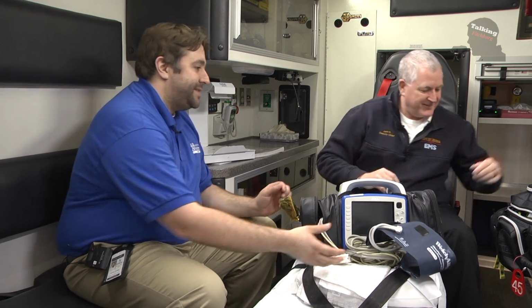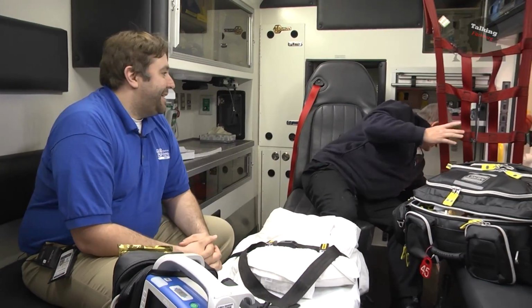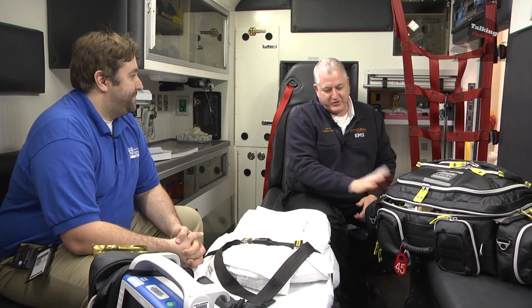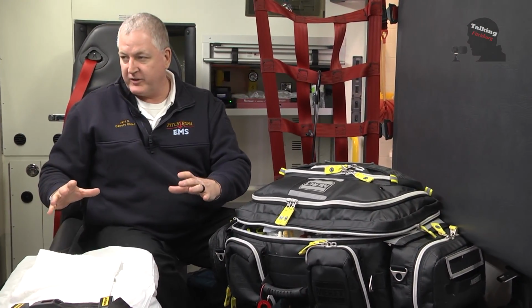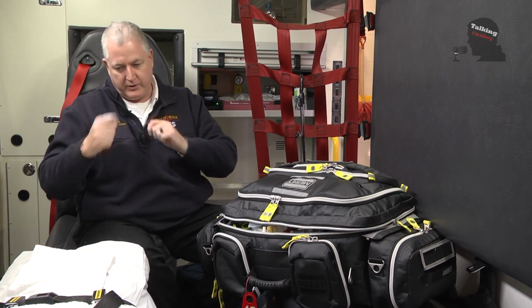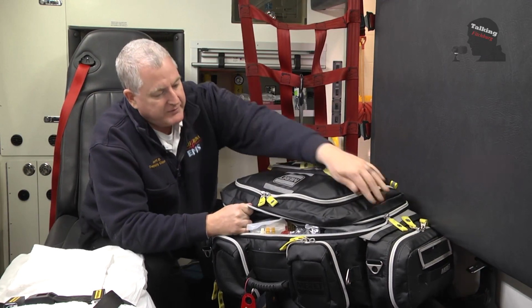And a staple of EMS is bringing in some type of bag, and the Merit bag is kind of the EMS classic jump bag for coming into your residence. This one's a little bit heavier, that's for sure. We have everything in here that we're going to need to initially take care of the patient. A lot of times the paramedics will work directly out of here when they get in the ambulance, just throw it on the bench or put it on the floor and work out of the bag. But inside, if I can get it opened up here.